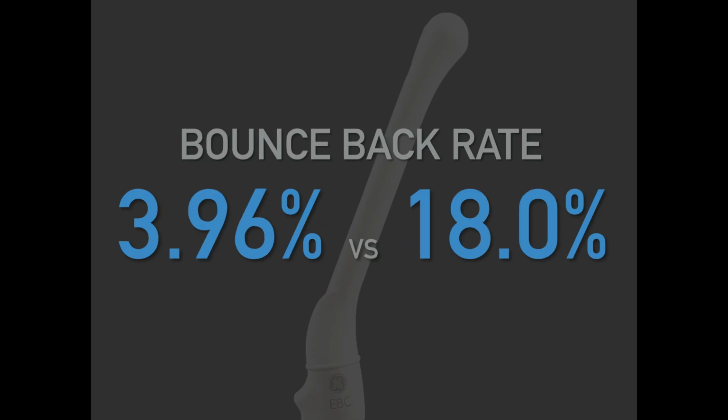Interestingly enough, and I thought this was really important, if you used ultrasound for your diagnosis of peritonsillar abscess, the patient was less likely to bounce back, which probably reflects some diagnostic ambiguity in the landmark approach. That was kind of my thought looking at the literature, but ultrasound makes you better in my opinion.